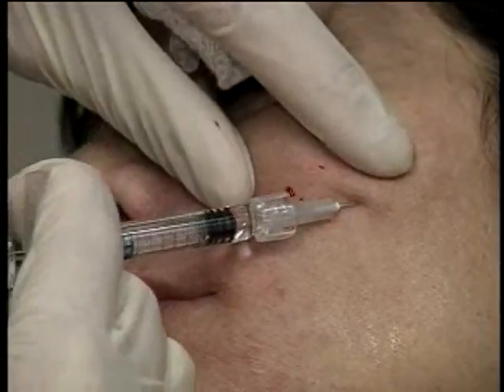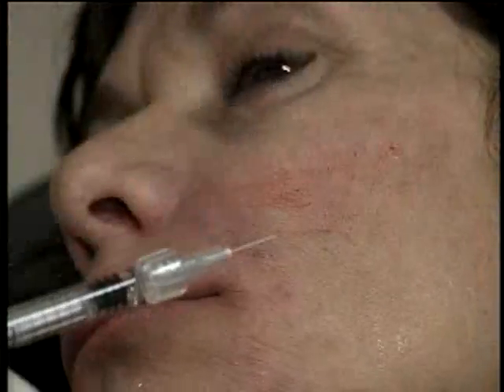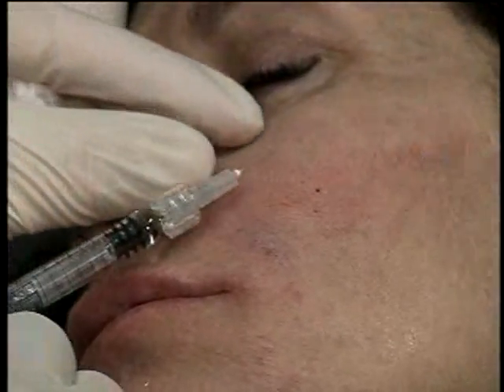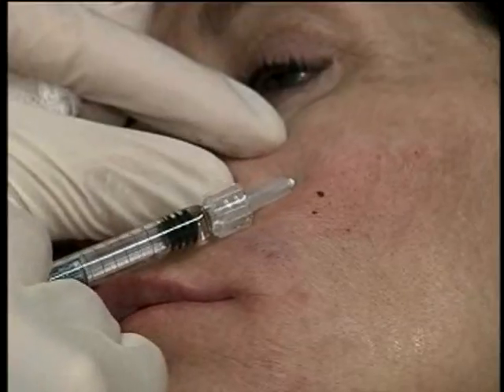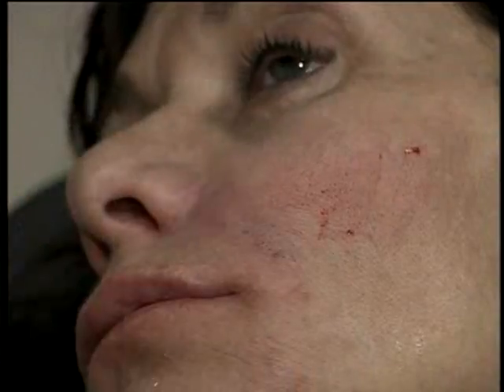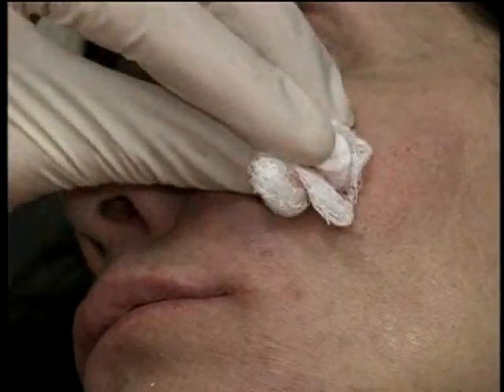And I'm filling in that whole area I painted out for you before with the makeup pencil. Okay. It takes quite a bit of Perlane to fill this area in, or for any filler for that matter, so I do really need to use quite a bit.